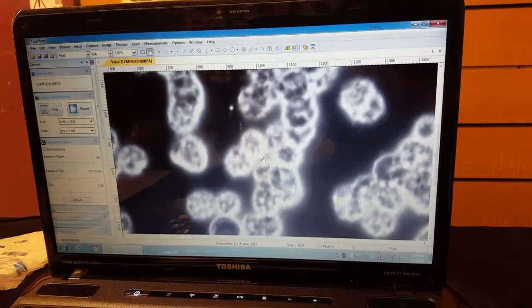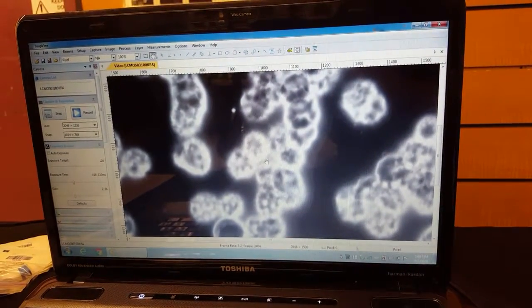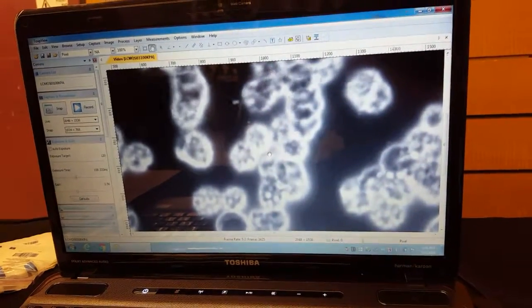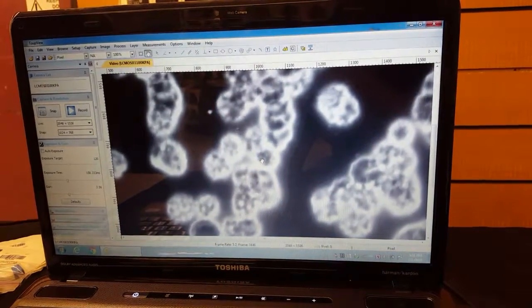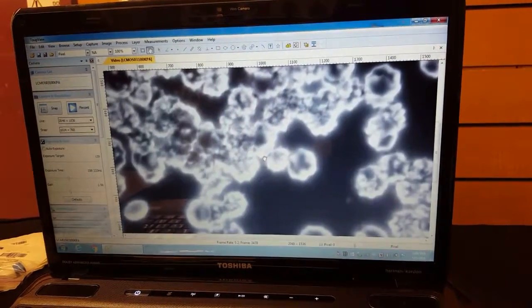I haven't seen any white cells yet. But we'll see. Look, for every 750 red cells, you should see some sort of white cells floating around, and I see a cell here that's white, so anyhow, that's good.